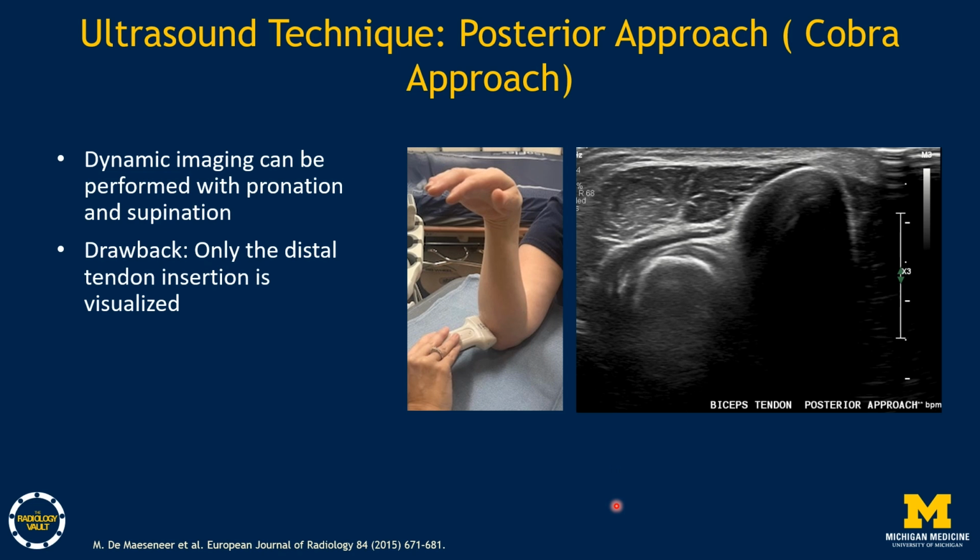A drawback with the posterior approach is that only the distal tendon insertion is visualized. We cannot see the most proximal tendon fibers.